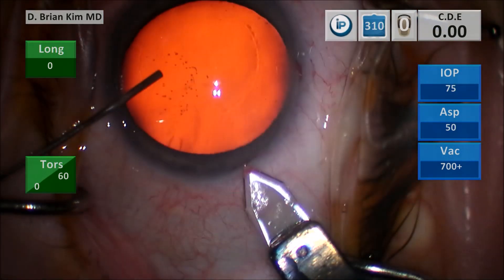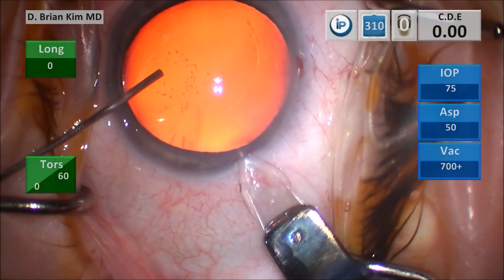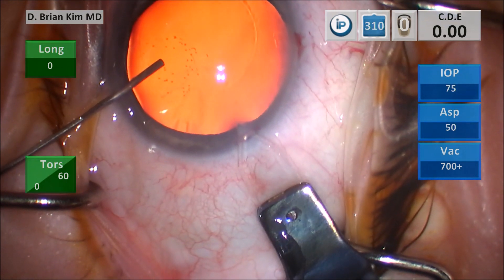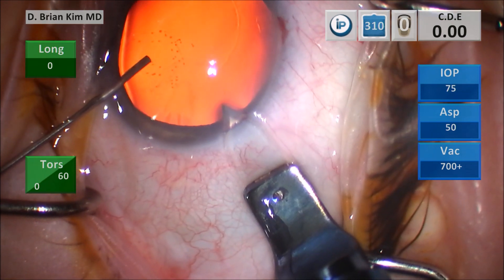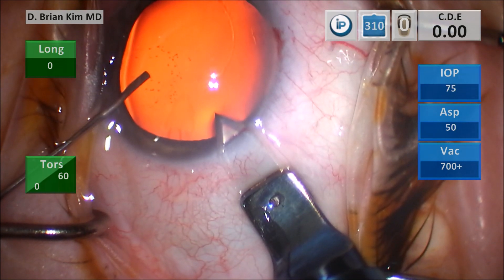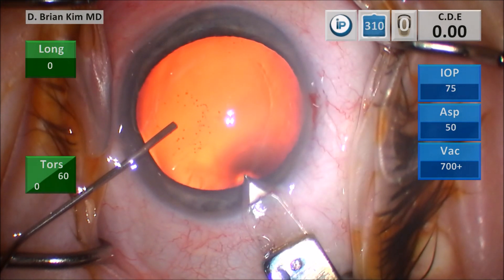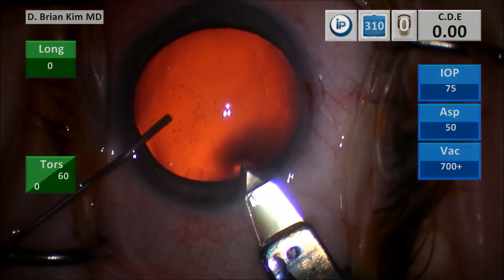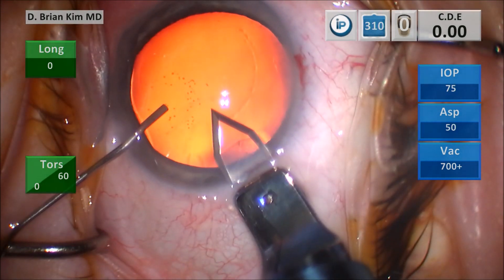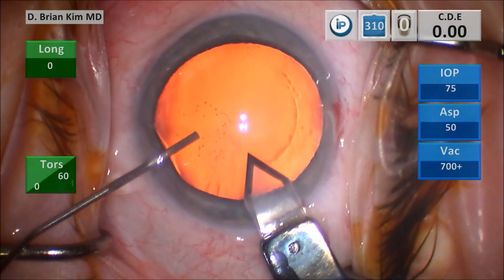I'm using the cannula — you can see I'm pushing with it so the eye is pointed a little bit away from me. I've already made my vertical groove about one-third depth. I find the deepest part of the incision and put my blade into that space, then flatten the blade so it's parallel to the cornea. I tunnel the blade and advance it until I reach the desired depth and tunnel length, then reposition and tilt the blade more vertically, facing toward the anterior capsule, and advance to create my triplanar incision.